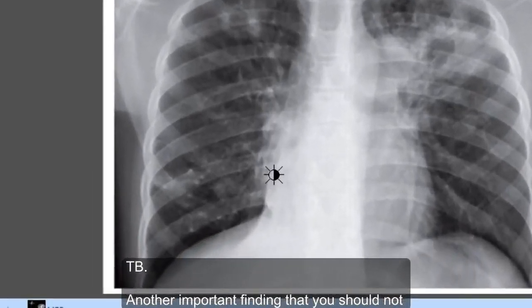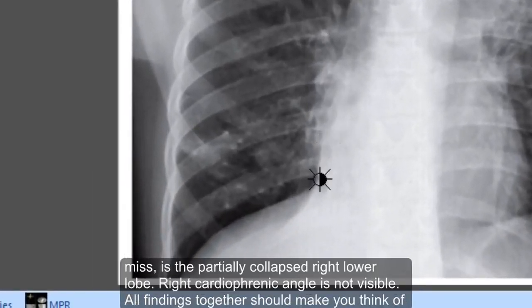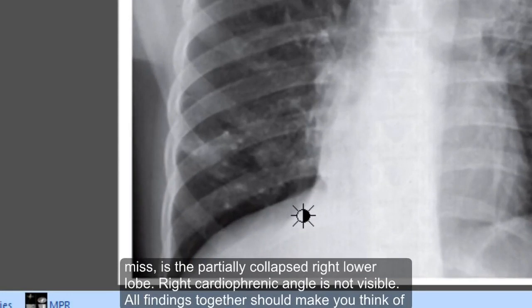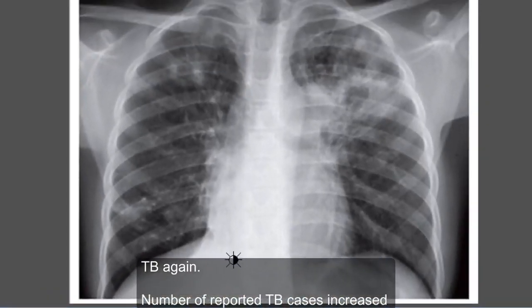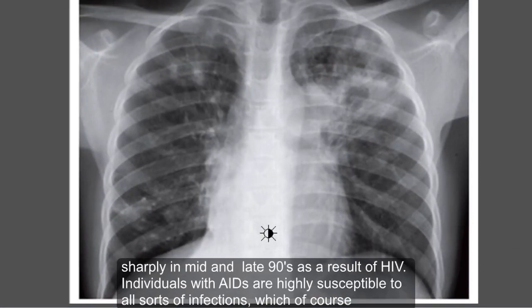All findings together should make you think of TB. Another finding that you should not miss is the partially collapsed right lower lobe — the right cardiophrenic angle is not visible. All these findings together are consistent with TB.